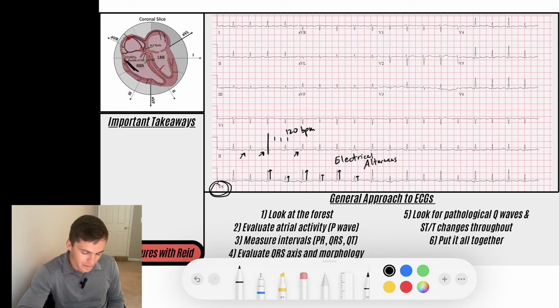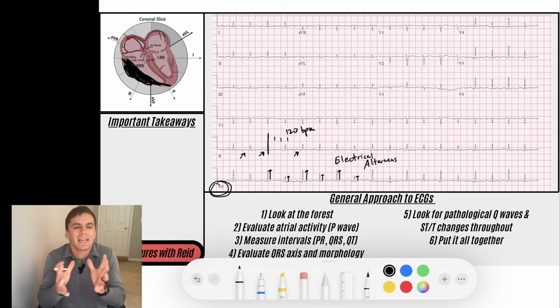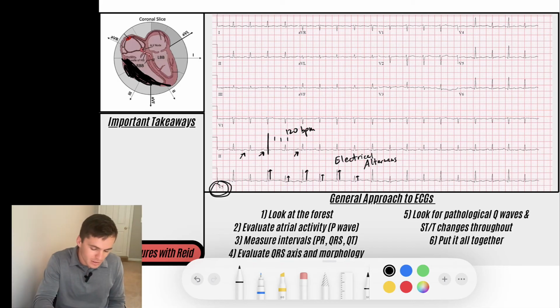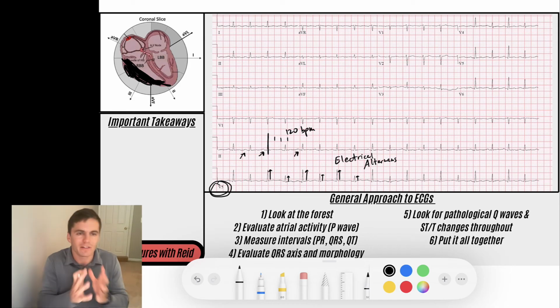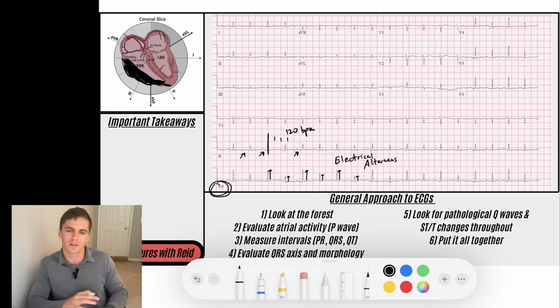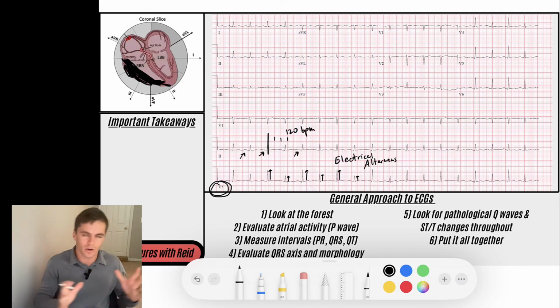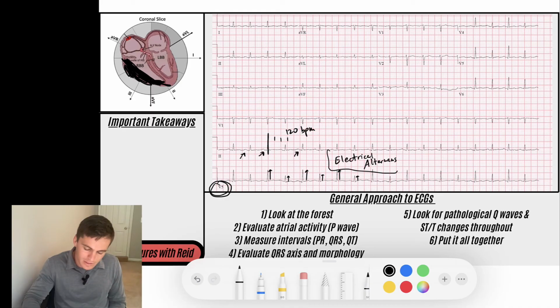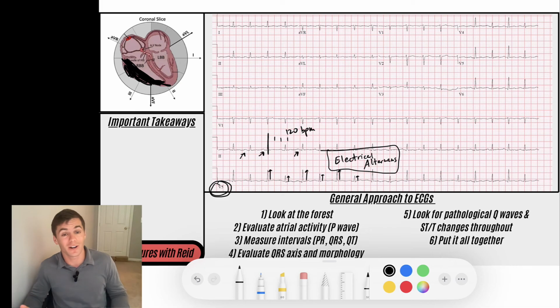It's abutting that right ventricle, so it's pushing in and it's essentially causing diastolic dysfunction of the RV. What does that mean? That means in diastole, when it's filling, it can't fill. That low pressure system can't fill because it's being impeded by all that fluid pressing, because the pressure of the fluid in this case is higher than the pressure of the venous return. And so now with all this fluid, the heart is rocking back and forth with every beat, and you get electrical alternans.